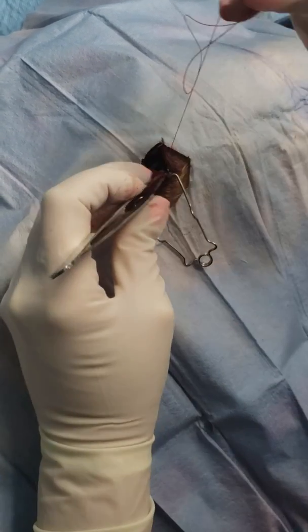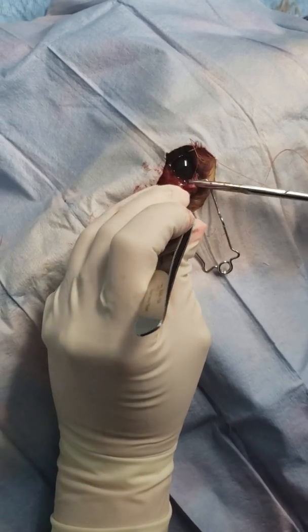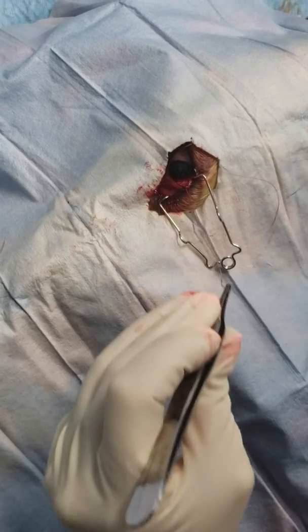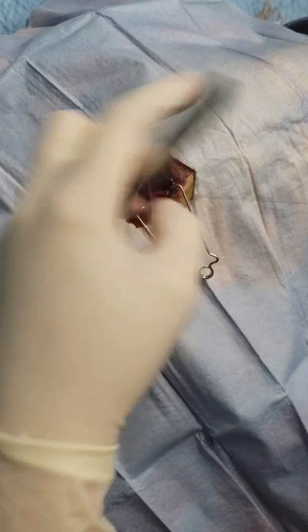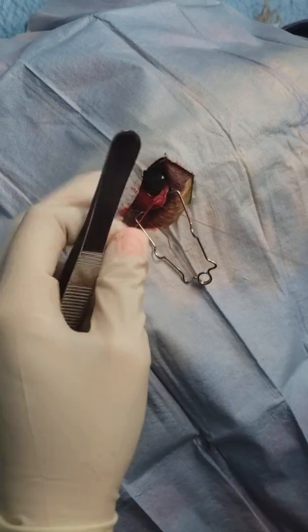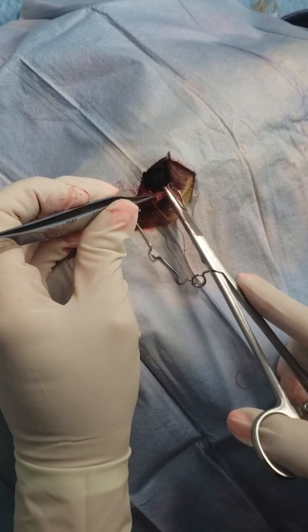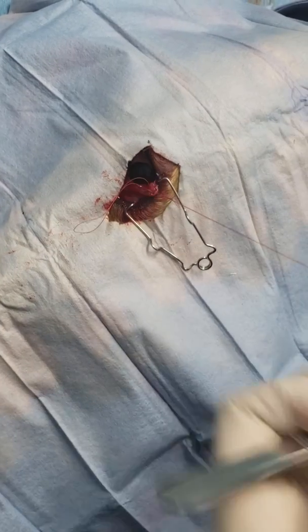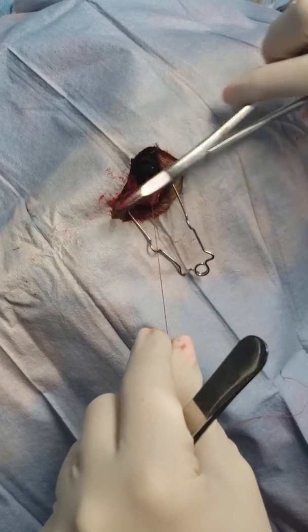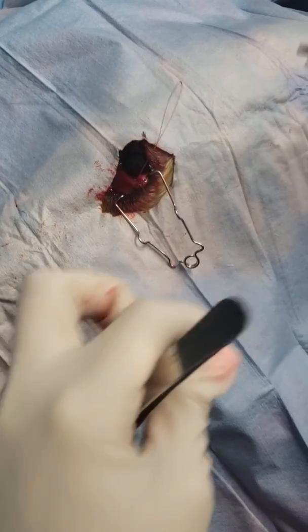So this strand is deep, and now this strand is deep — so both ends of this loop are deep. I'm going to come back around and get one more that comes out really close to that, so I can tie them together. Now I've got three strands of deep suture that I'm going to tie together at the end.